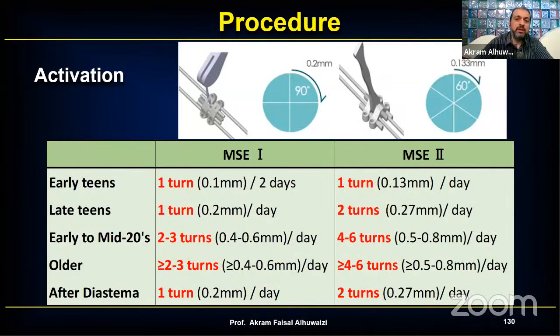So how many turns do we need? If you notice, the amount of turns will depend generally. I've summarized this from the brochure of the company itself, and it depends on the age. The older you are, the more you need to put force on the expander, the more you need to put force on the palate so that it can crack open.